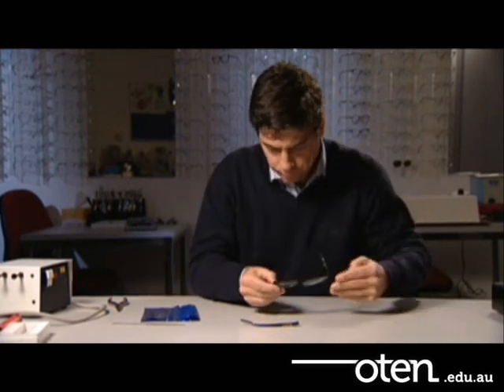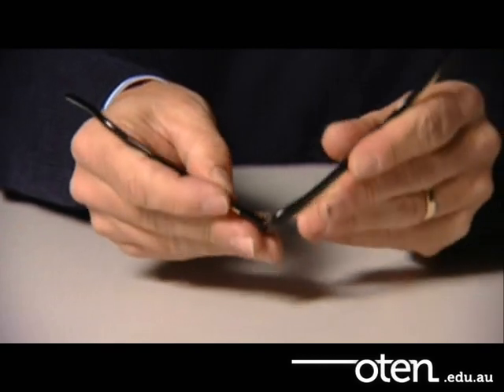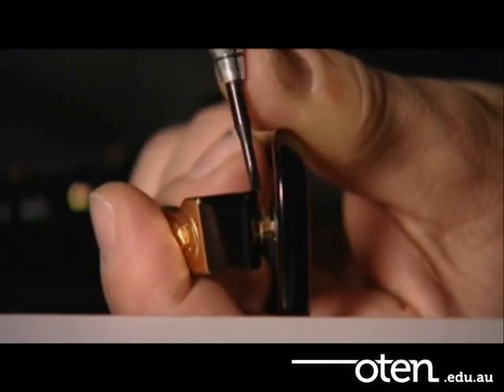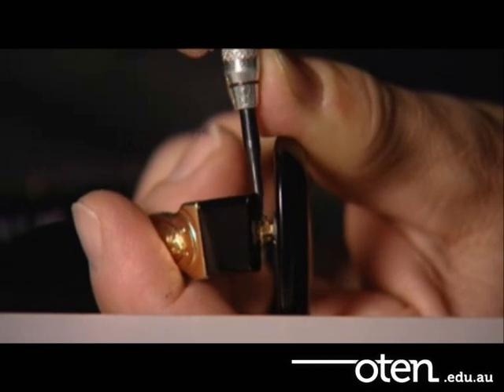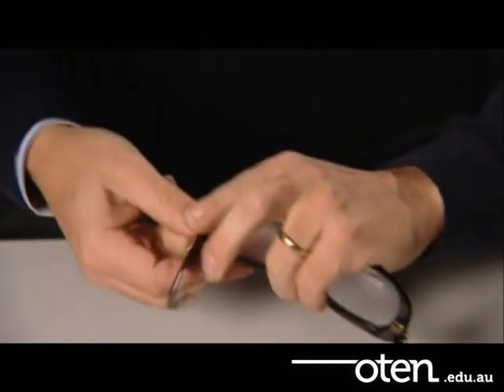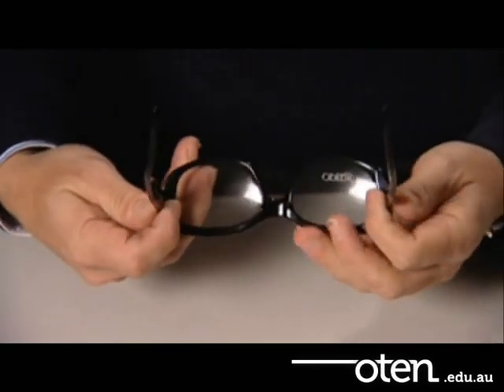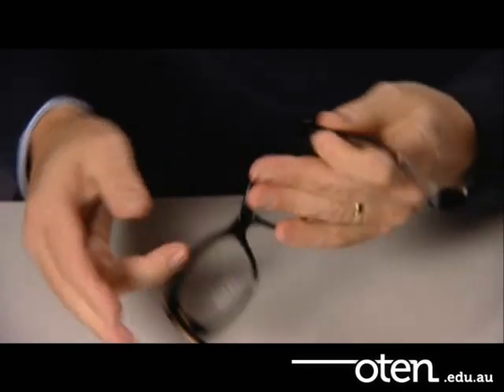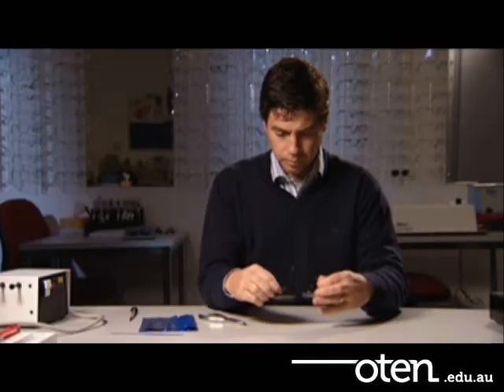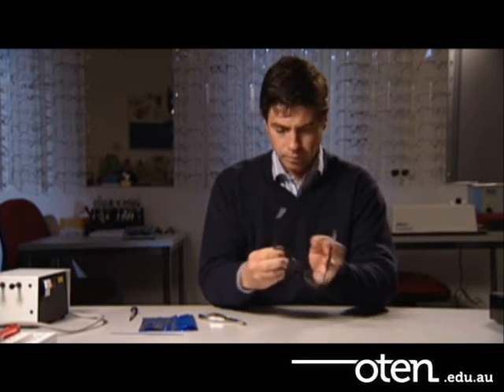Finally, reattach the temple by putting the screw in. Take special care with the temple alignment. Check the let back and temple angles and match them to the other temple. If they don't match, use the appropriate tools and adjustment techniques to ensure that the frame is brought back into standard alignment.